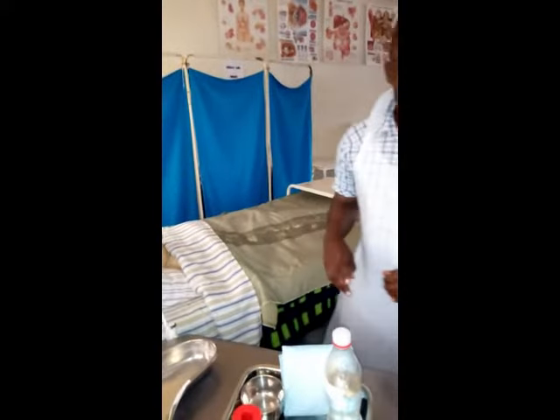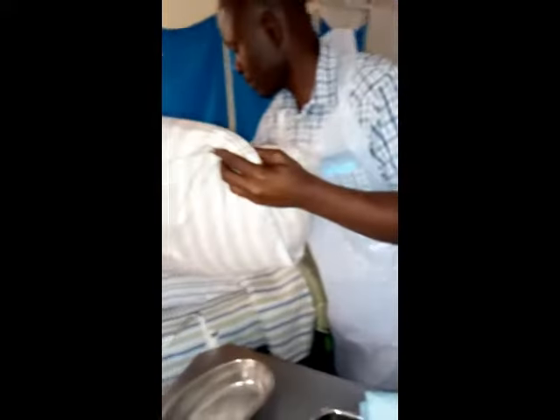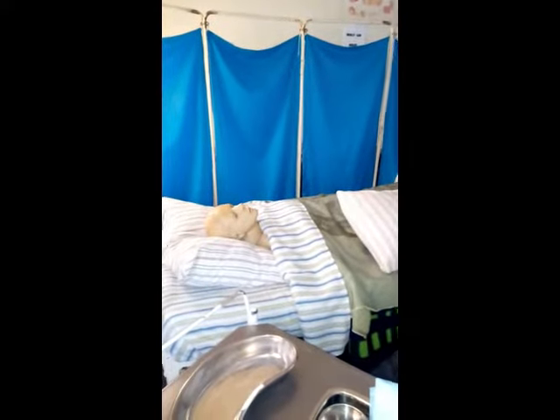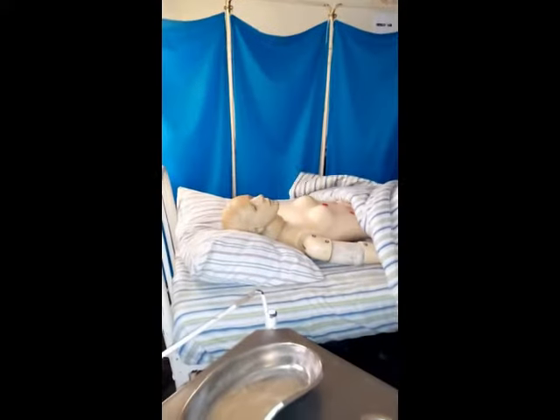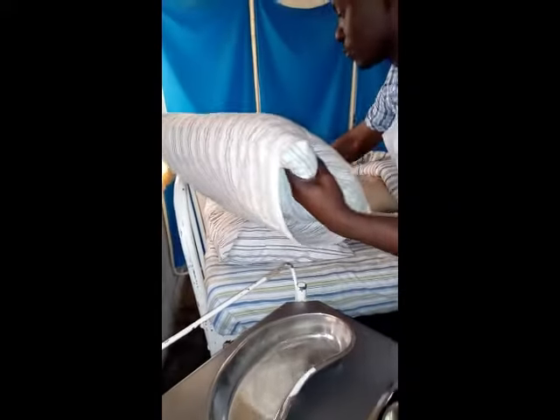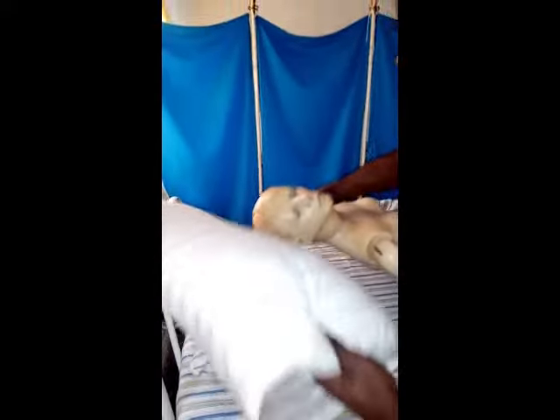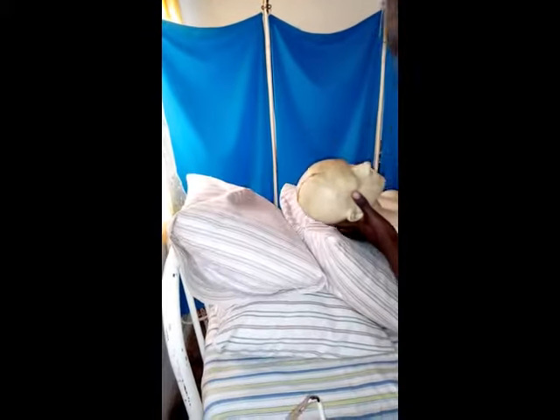So let's have Mrs. Mwape keep going. Mrs. Mwape, kindly sit up. Then Mrs. Mwape has to sit up. Since it's a dummy, let's try to prop up the dummy. If you want to score marks in OSCE, you need to make the patient sit up. Even on the ward, if you're working, a patient who is able to sit has to sit up, so that you do this procedure nicely.